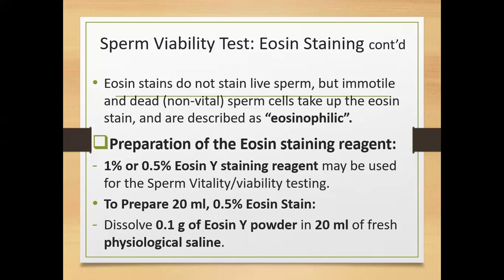But what did I say about the water? I said that in assessing your sperm morphology, if the container that was provided for the patient had even a drop of water, it can cause an abnormality. You remember that. The cell membrane is only semi-permeable, as Rhoda wrote on the platform.